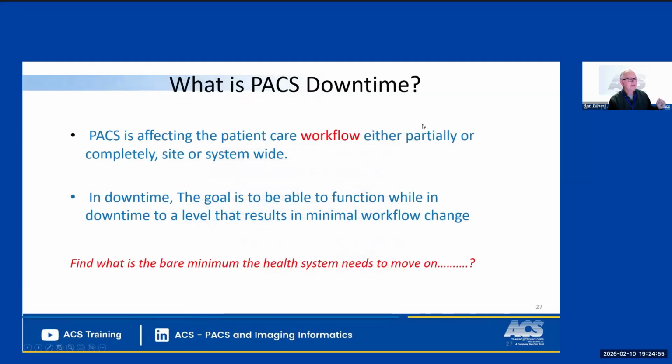First, what is downtime? We're going to define that. Basically, this is my quote, because I couldn't find a really good one that I liked. PACS is affecting the patient care workflow, not patient care. People say, this is affecting patient care. Well, you know what? Every time you step in, put your badge on, and you're in a hospital, everything you do is patient care.